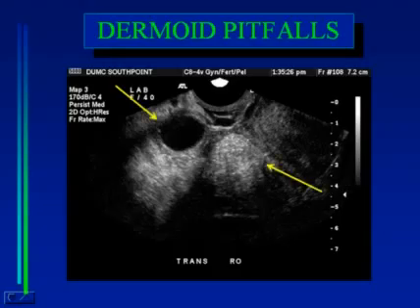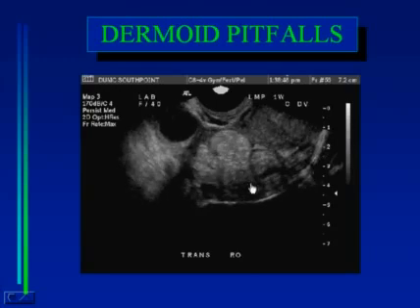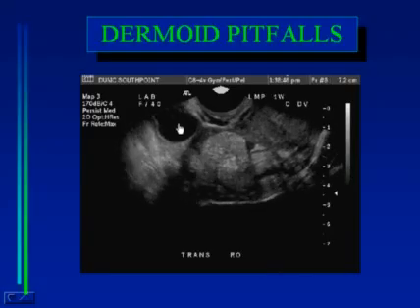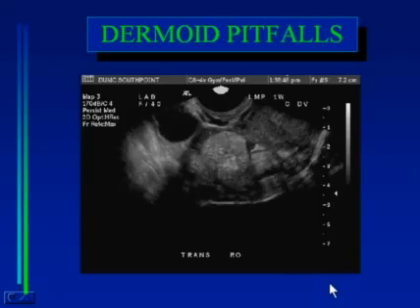We had what looked like a complex mass within the ovary with both a cystic component as well as a solid component shown here, which would be a good candidate for a dermoid. However, when additional scanning was done, this area began to peristalse, and therefore it could be confidently diagnosed as just representing bowel. This was normal bowel, with the cystic area that had been seen earlier simply being a prominent follicle in a normal ovary.